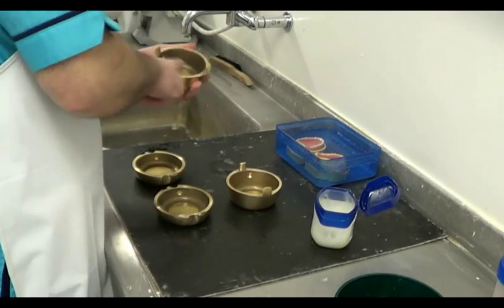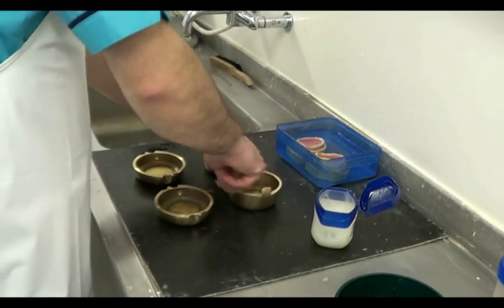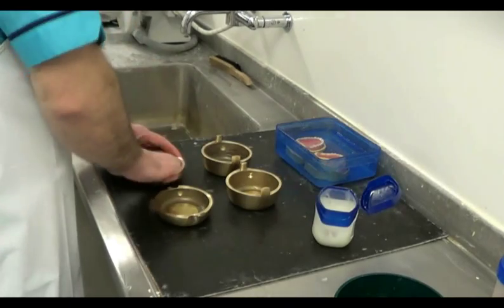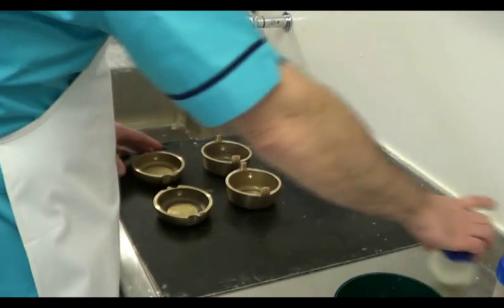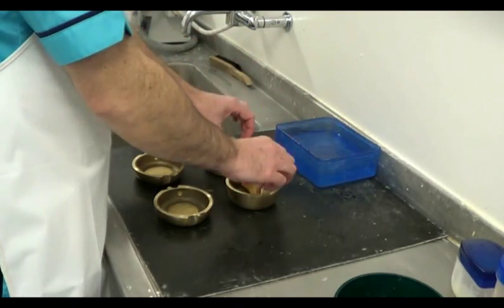To prepare for flasking, we'll require two flasks with individual metal buttons placed inside them, and both of these items will be lubricated with petroleum jelly. The completed dentures on their models should be soaked in water prior to flasking.